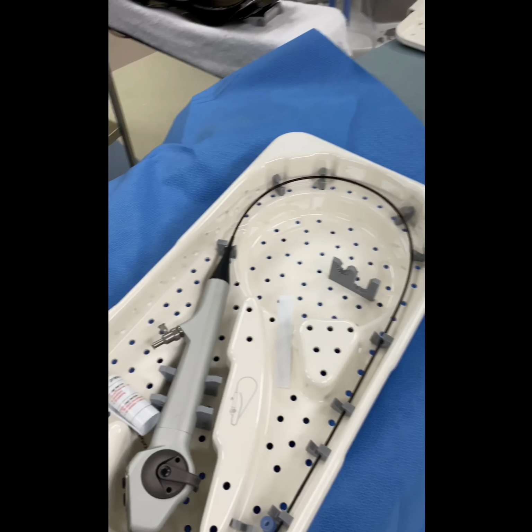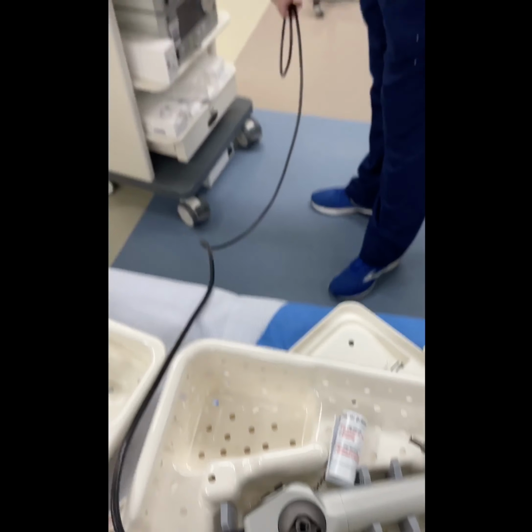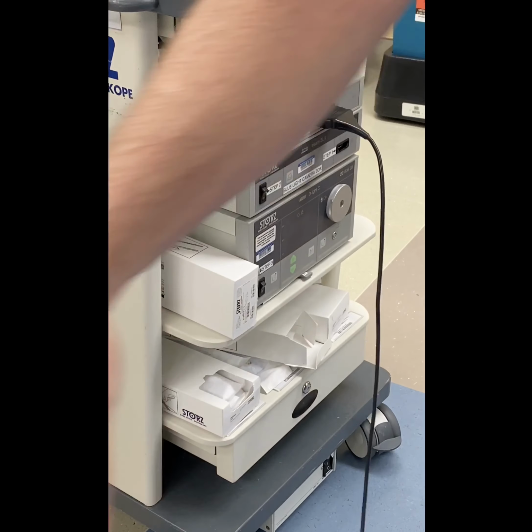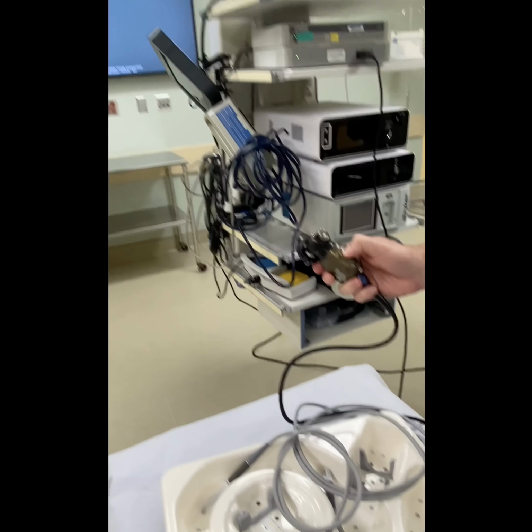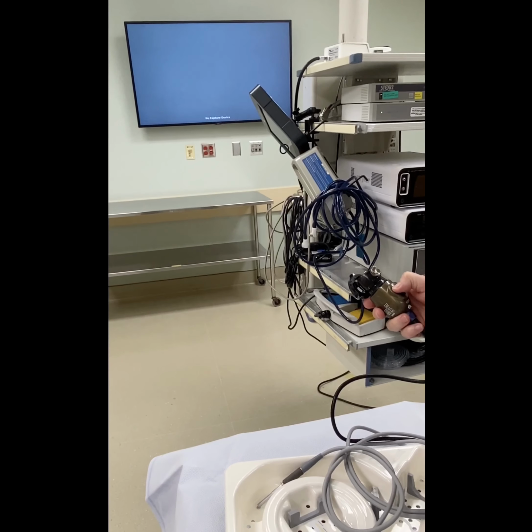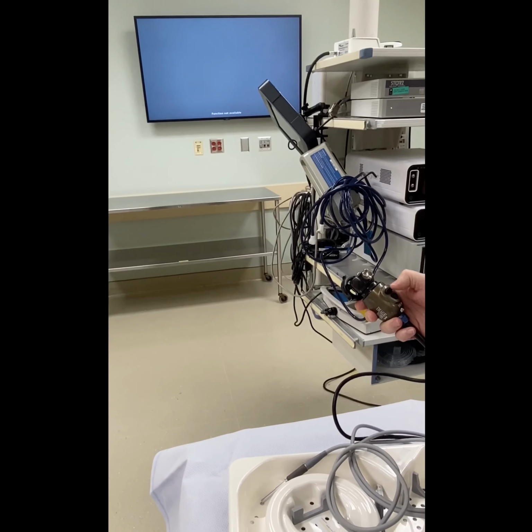Now be very gentle with this, guys. This is our best friend. The digital ureteroscope plugs into the digital ureteroscope video box there on the blue light cart. What shortcut do you have to switch over? It's going to be the top left button. To toggle the screen from the downward camera to the digital ureteroscope, you're going to hit the top left button.